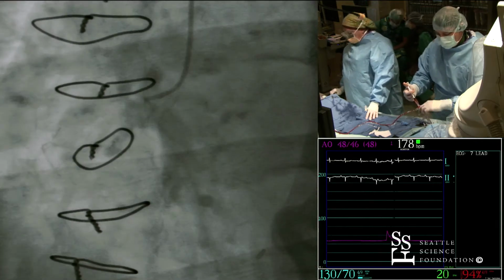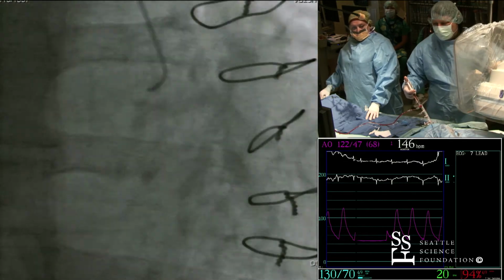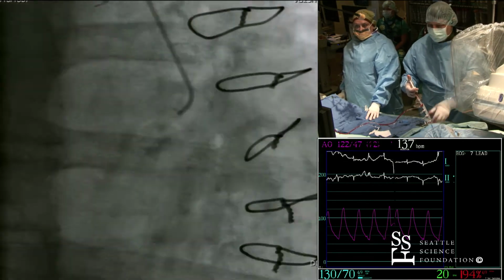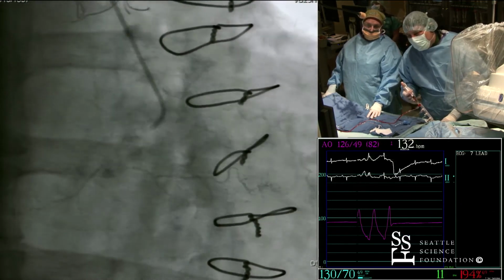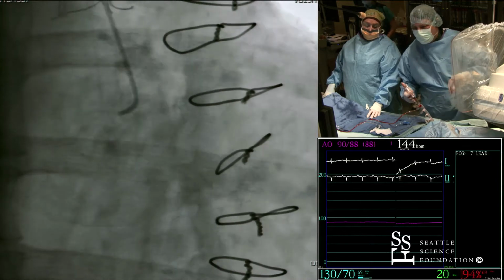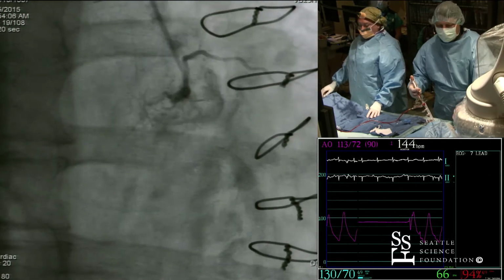Okay. When you go from the right wrist, it's over to an opposite RAO. But you need to know both. There are patients that you're going to do from the right wrist, there are patients you're going to do from the left wrist. So stay on that just for the CTO purposes. Okay. Come to straight AP. Go to 15 LAO if you would.